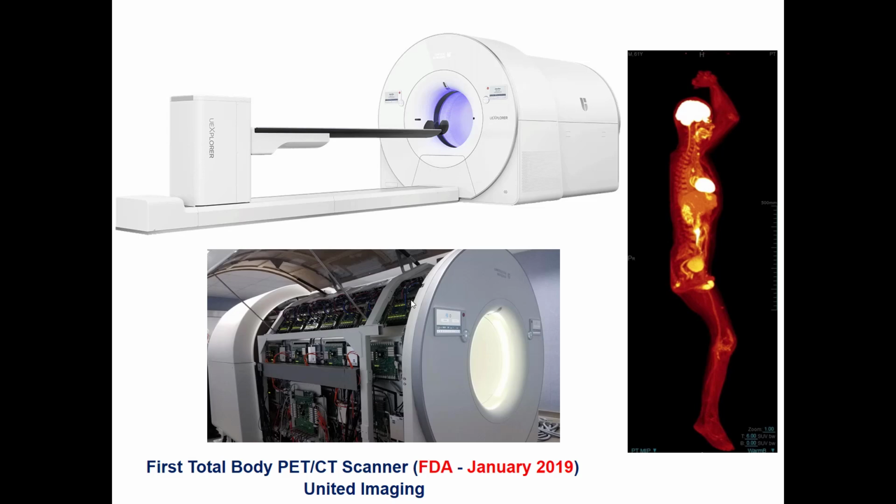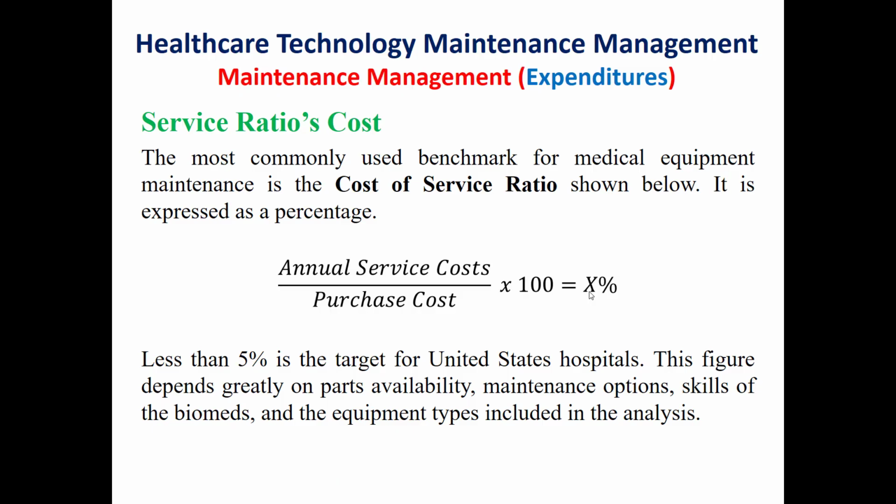This also is the same. As we can see, we have a lot of electronic boards and components. We should also consider the labor cost for such technology. Thus, as we said, we should make an analysis of the complete cost, the initial cost and the running cost of the device.